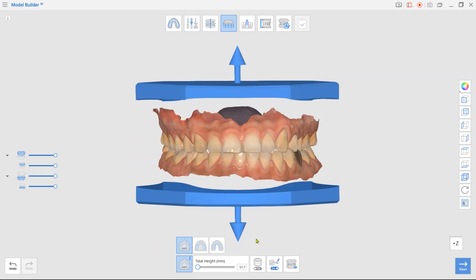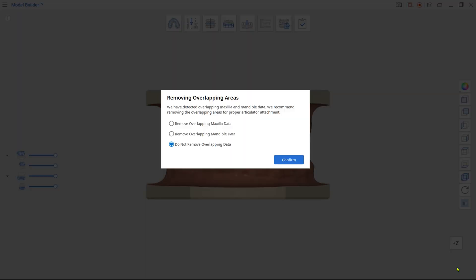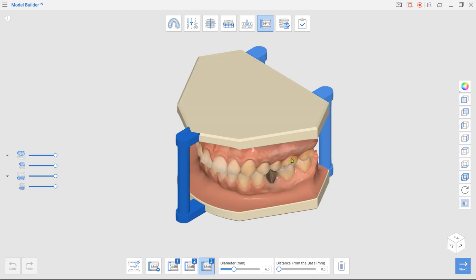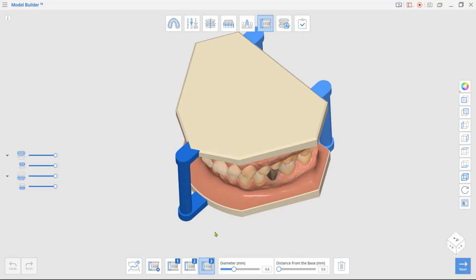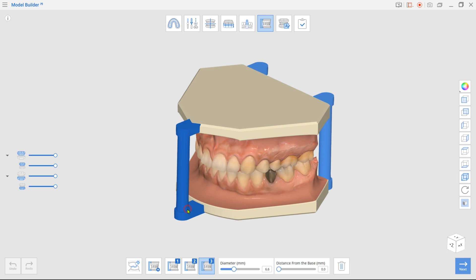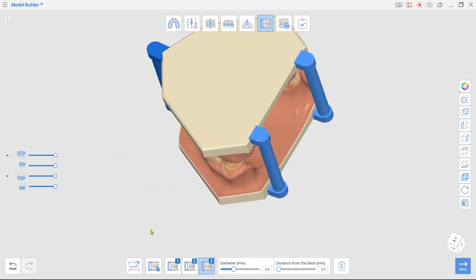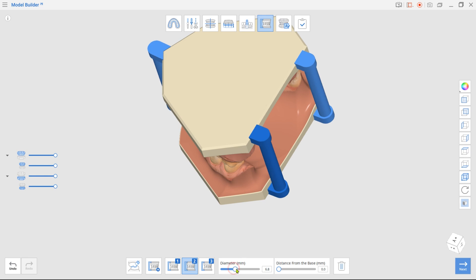Then skip to Articulator mode. The program will automatically attach three articulators. Click and drag each articulator to adjust its placement. Use the Diameter slider to change their thickness.